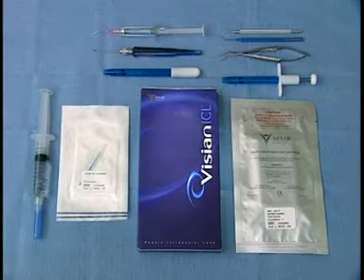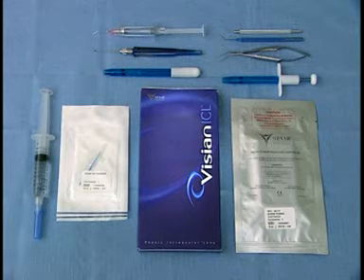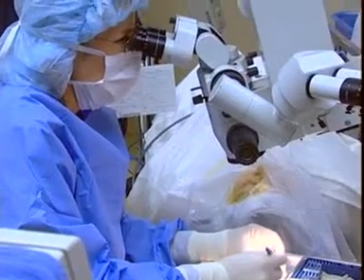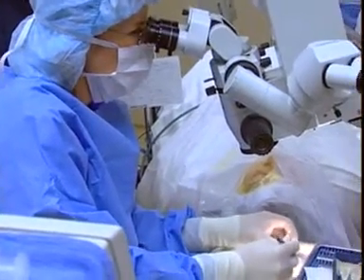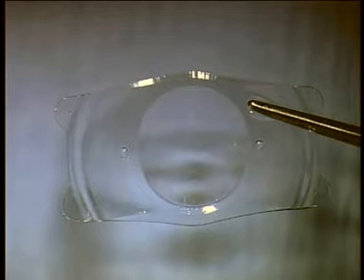Using the Star ICL injection system, the ICL is injected through the MSI-PF push action or MSI-TF twist action injectors. The SFC-45 cartridge requires a 3 to 3.2 mm incision. The loading of the ICL is a critical component of the overall procedure and should be performed under the operating microscope. The delivery of the implant into the anterior chamber is largely dependent on the precise and careful loading of the ICL. The Star ICL is made from Collamer, a hydrophilic collagen copolymer.